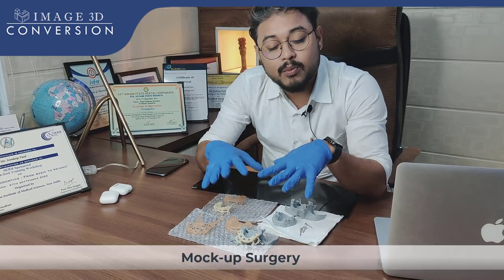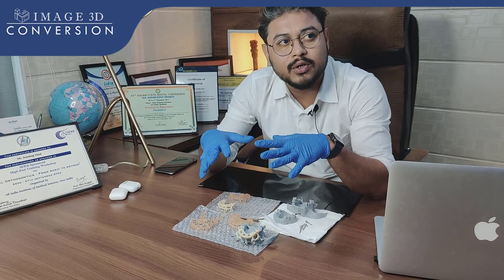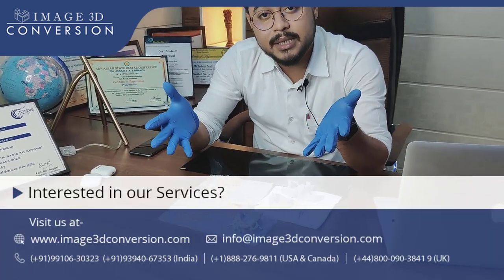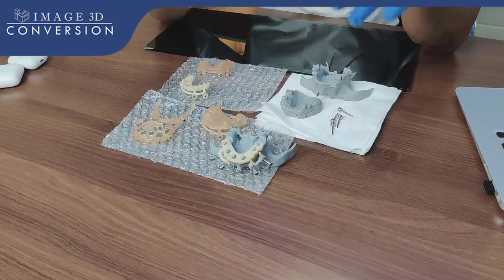First, try one mock-up surgery where you can evaluate the kind of challenges you are going to face in real-time surgery — whether your surgical guide will be stabilizing properly. You can evaluate and counter that before the actual surgery.